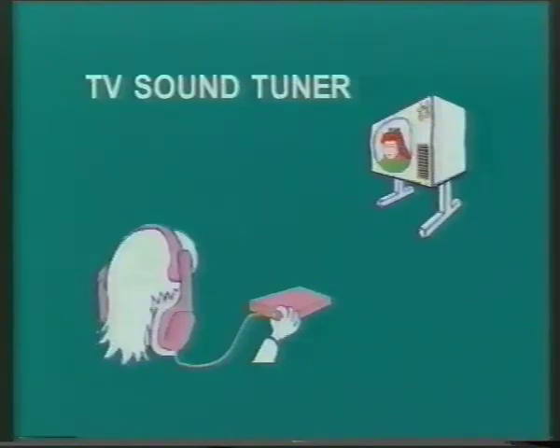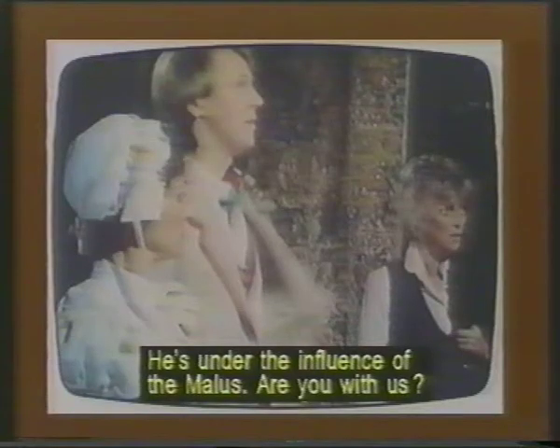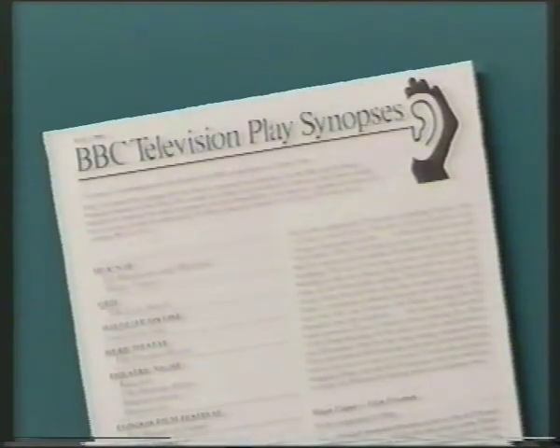TV sound tuners can be tuned to receive sound from TV stations. They can be used either with headphones or with a hearing aid on the T setting. People who cannot hear amplified sound may use teletext to receive subtitles for a range of programs. Printed synopses of a selection of TV plays are also available.